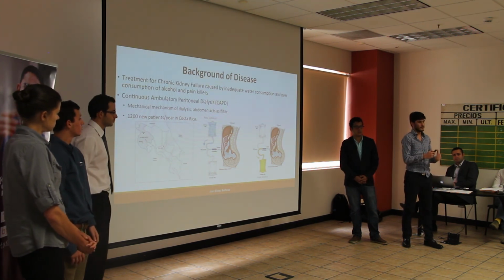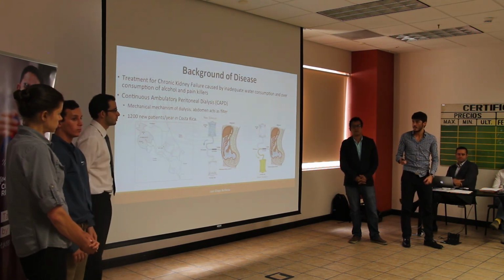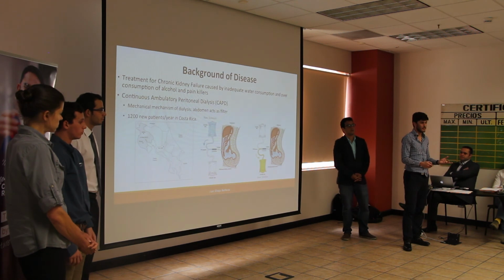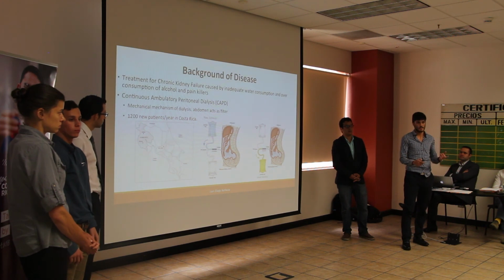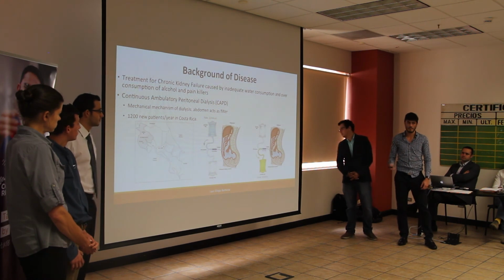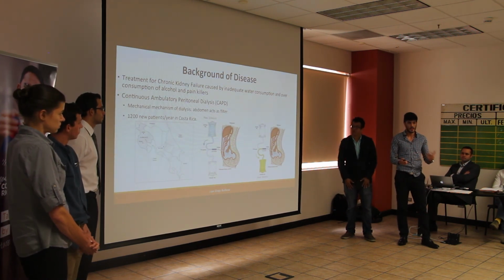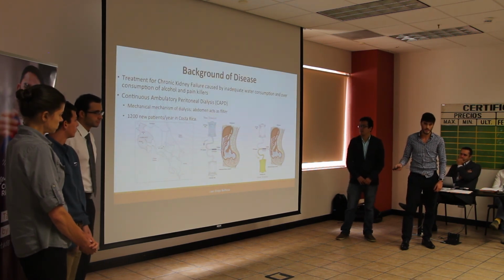The thing is that lots of people have to walk long hours to get to the Liberia hospital to get their hemodialysis treatment. So one practical solution is what we call CAPD, or continuous ambulatory peritoneal dialysis, which can be done at home. It lasts about an hour per treatment. It consists of a system of 2 fluid bags and a regulator. The fluid bag contains a pure fluid with lots of salt that is inserted into the peritoneal cavity in order to absorb toxins in the body. Once it enters, it absorbs the toxins and then comes out as a waste bag.